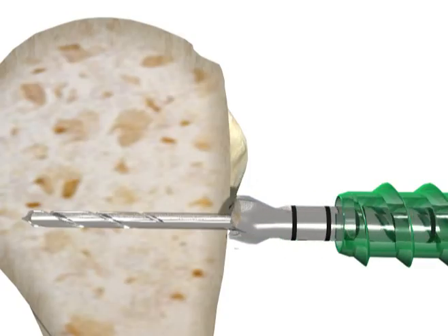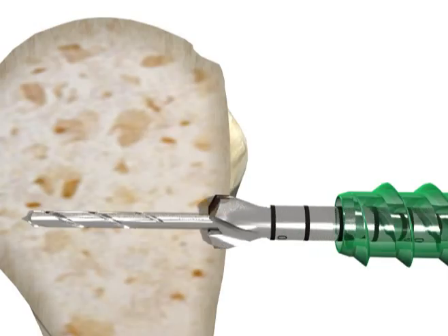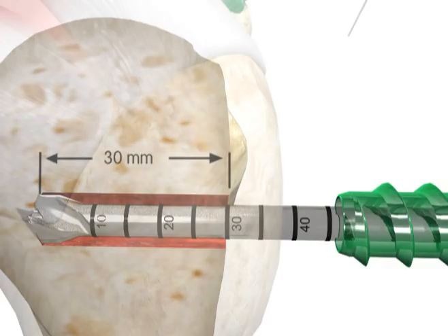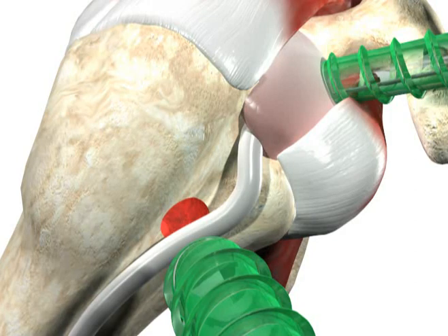Keep the 2.4 millimeter guide wire in place and ream over with the appropriately sized endoscopic drill XL to a depth of 30 millimeters. Use line to line sizing. For example, use an 8 millimeter endoscopic drill for an 8 millimeter interference screw.